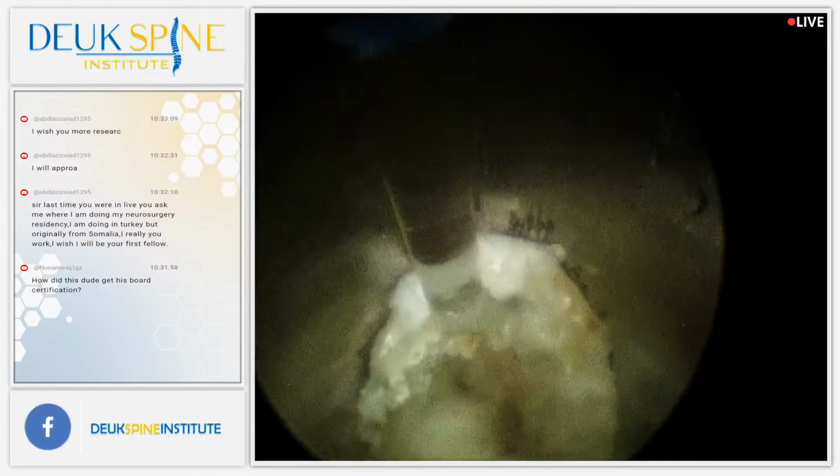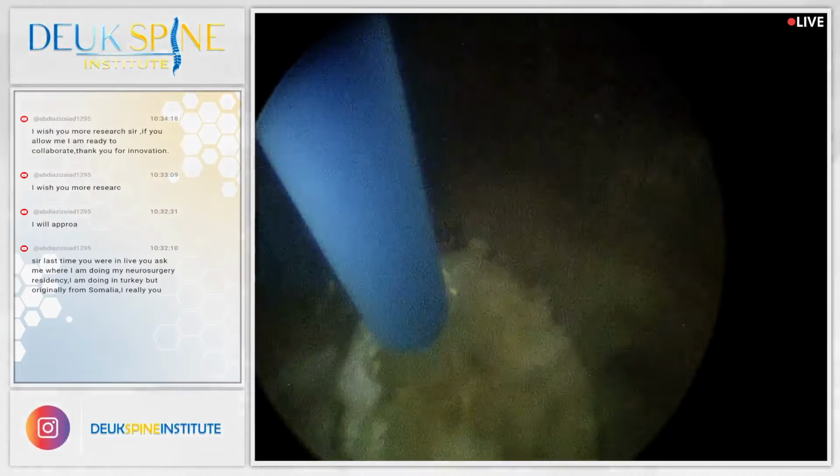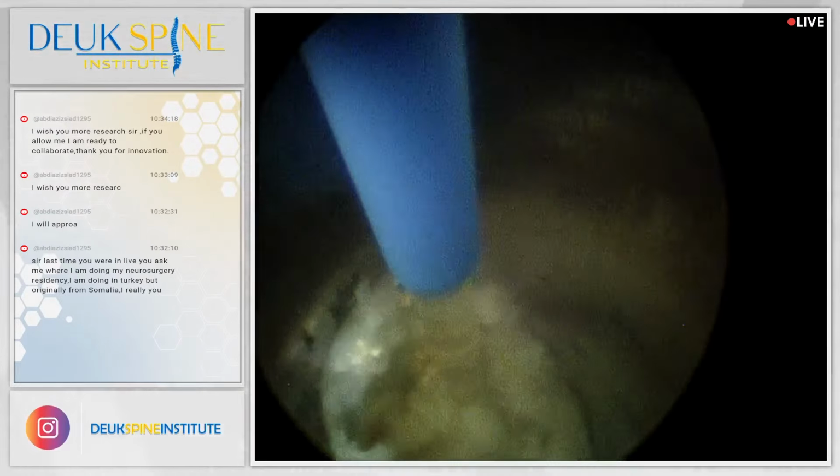That's what this surgery does. It's the first surgery in the world to directly address the pain fibers that have grown into the back of the disc, the annulus, with a laser. Laser is the best way to get rid of them. That's what I'm doing right now. I'm removing the pain fibers.